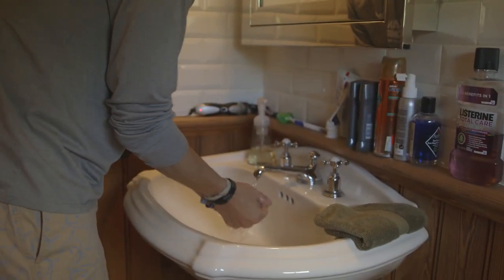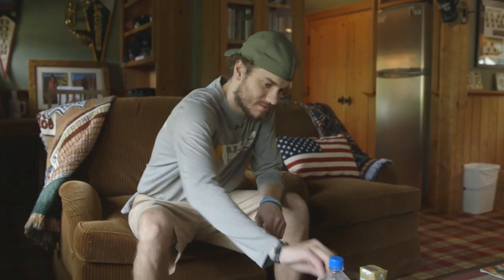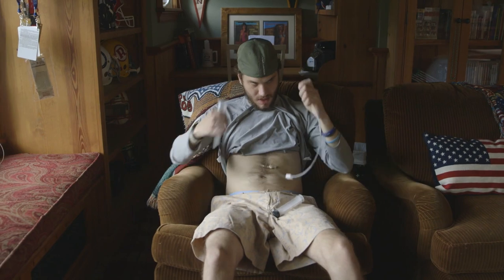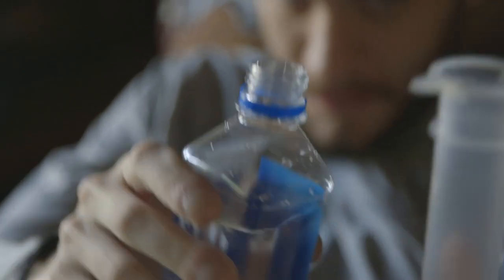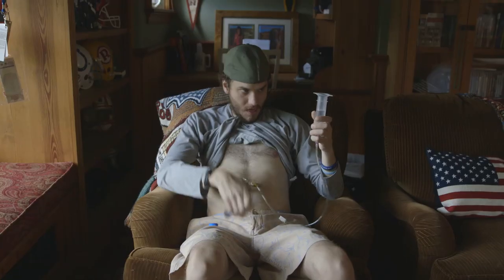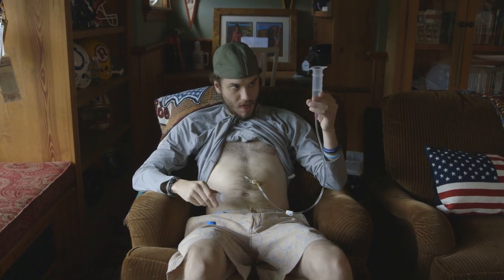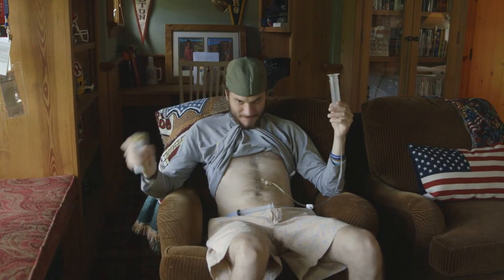Start by washing your hands. Sit down. Connect the tubing and syringe to your button. Unclamp the extension set. Pour or draw room temperature water into the syringe and flush. Shake the formula well, then pour directly into the syringe and let gravity do the work.